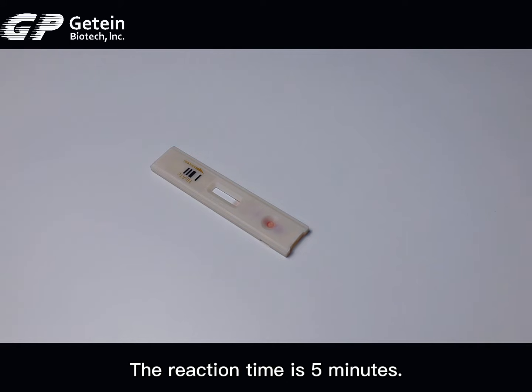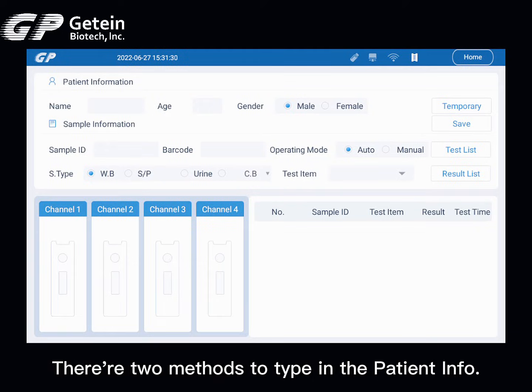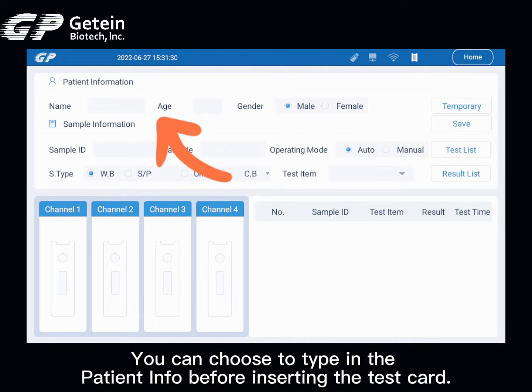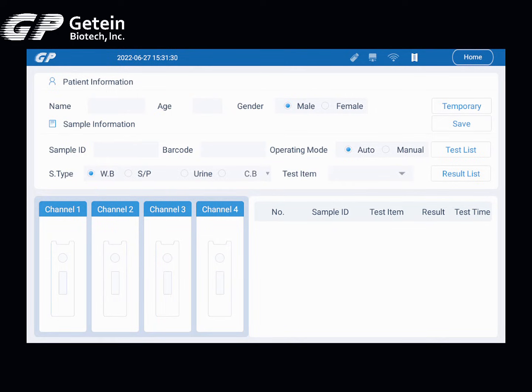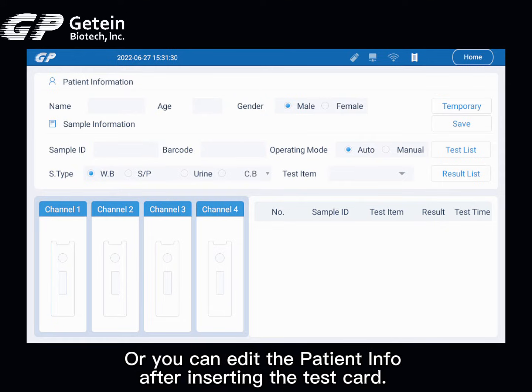The reaction time is 5 minutes. There are two methods to enter patient info. You can choose to type in the patient info before inserting the test card, then type in the sample ID and choose the sample type. Or, you can edit the patient info after inserting the test card.